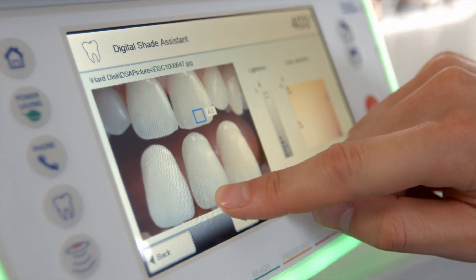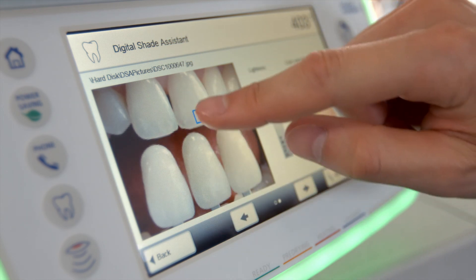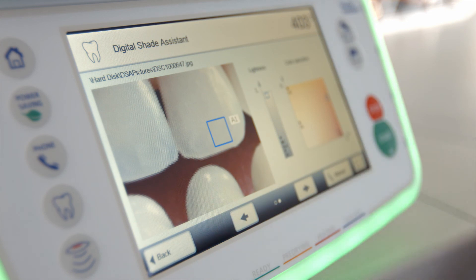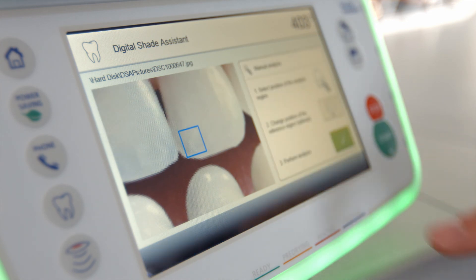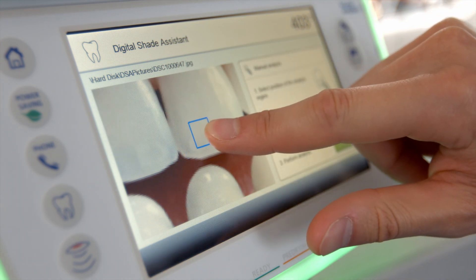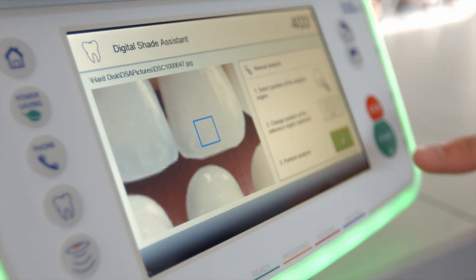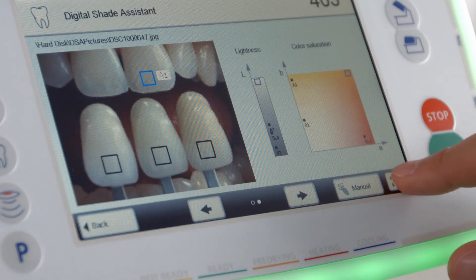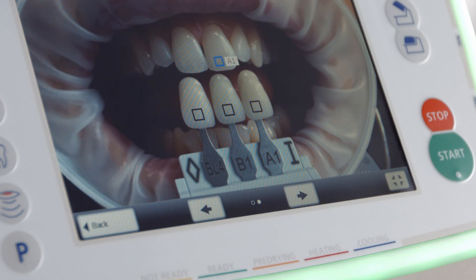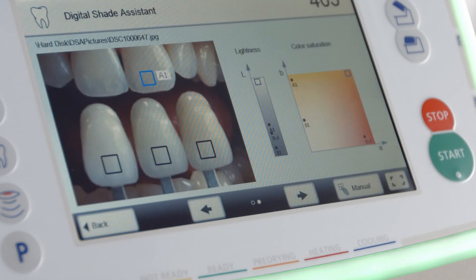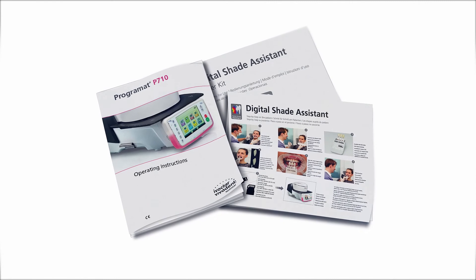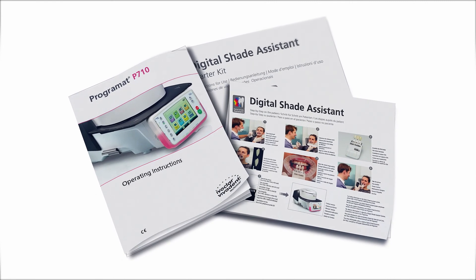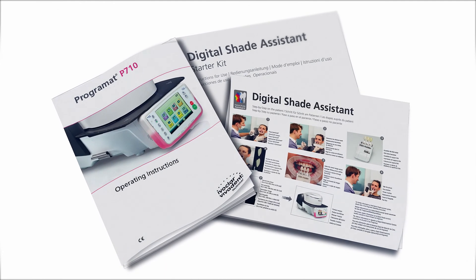You can move or change the image section with your finger. By double clicking, you can enlarge the picture and start a manual analysis to obtain a detailed analysis of a specific area. Press the full screen view button to look at the picture in full screen mode. For further information, please consult the operating instructions of the furnace or the accompanying documentation of the digital shade assistant.